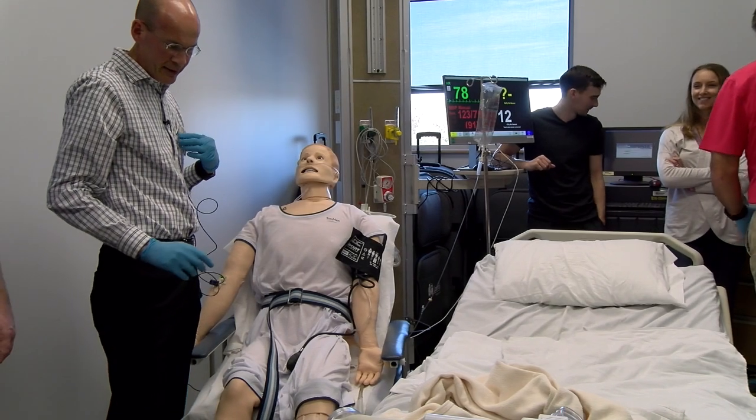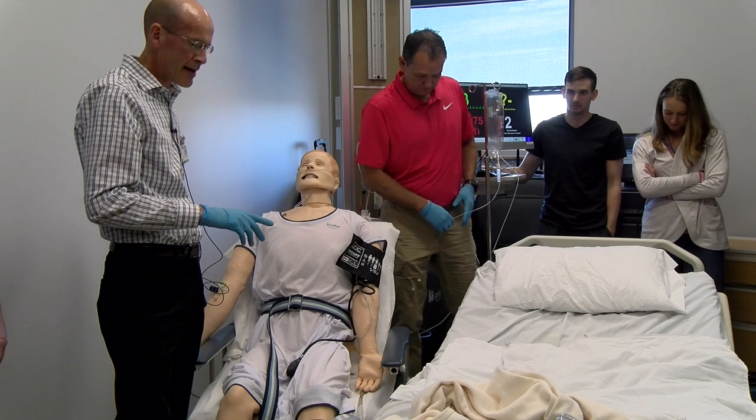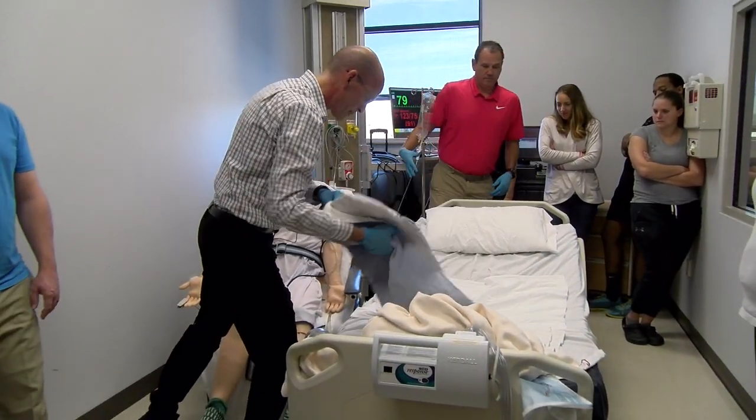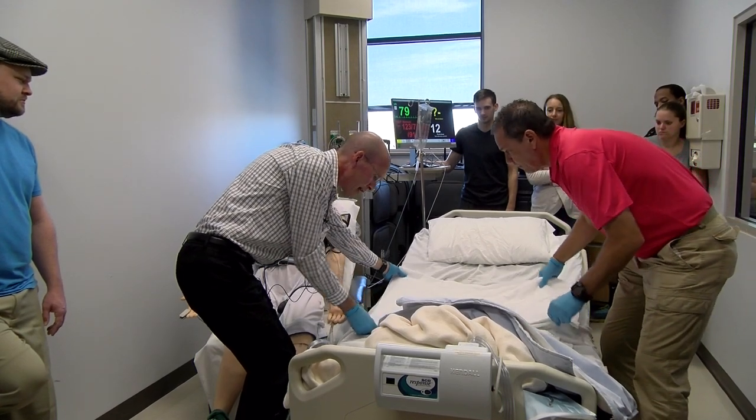Okay. You might have nightmares. So before we get him back to bed, we want to try to get the bed as ready as we can. I'm going to move stuff out of the way — move Mr. Jenkins' pad out of the way, straighten this out, straighten the sheets out a little bit.